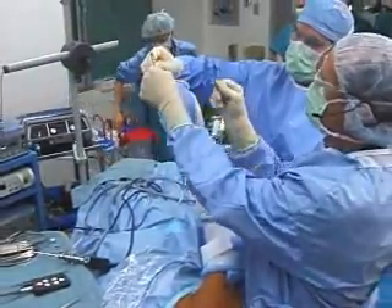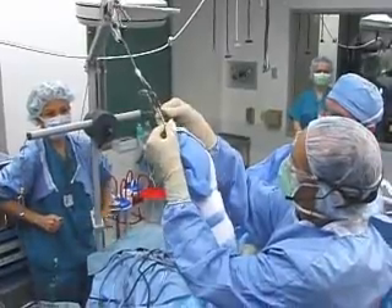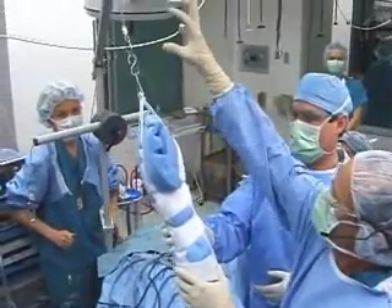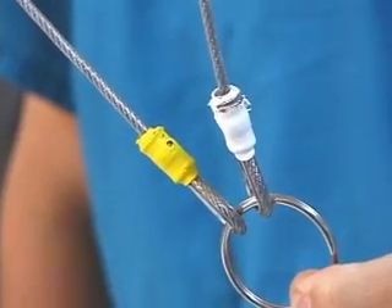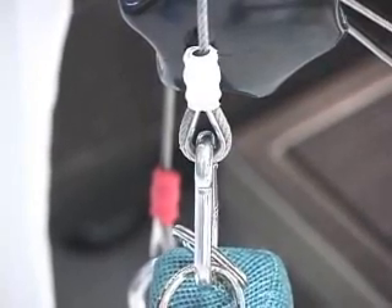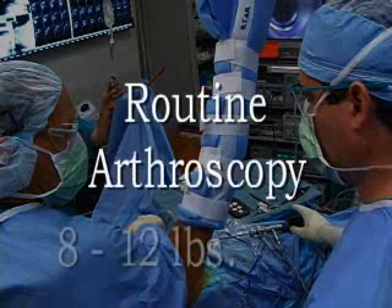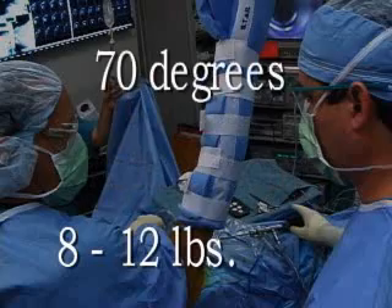Once the sleeve is applied, with the help of the circulator and maintaining sterile technique, an S hook is attached to the D ring into the upper white and lower yellow traction cable ring. Note that the white and yellow cables are permanently joined at this ring. Traction weights are applied to the end of the traction cable, the amount determined by the needs of the procedure. For routine shoulder arthroscopy, eight to twelve pounds of weight is given to the upper traction cable or white cable, which places the arm in 70 degrees of abduction.